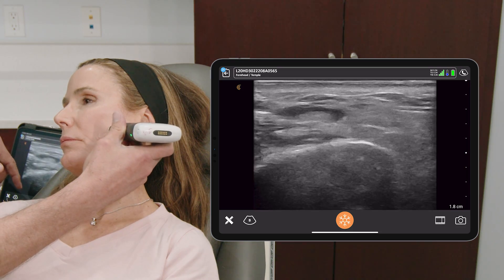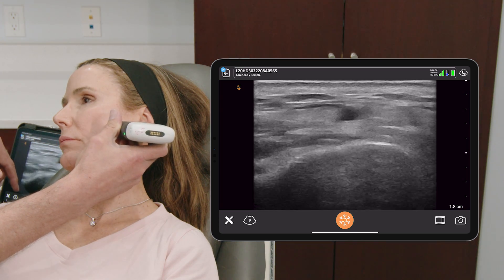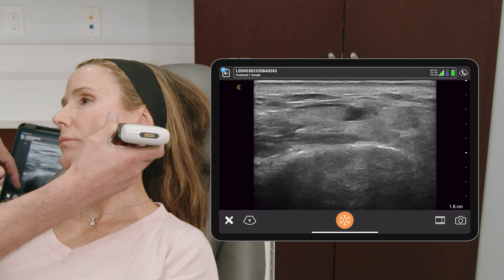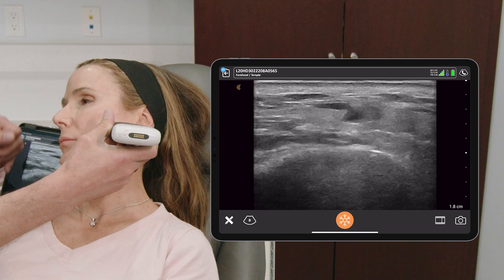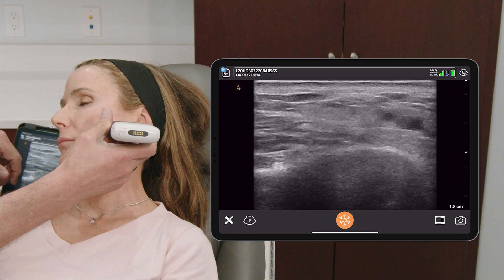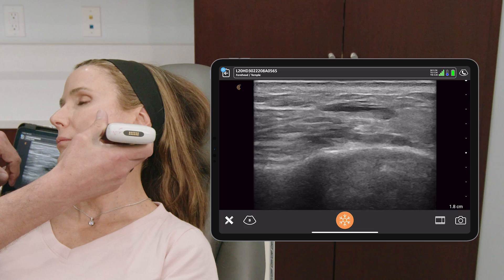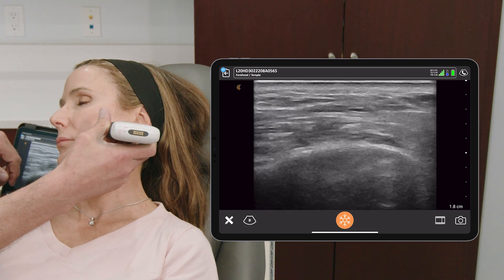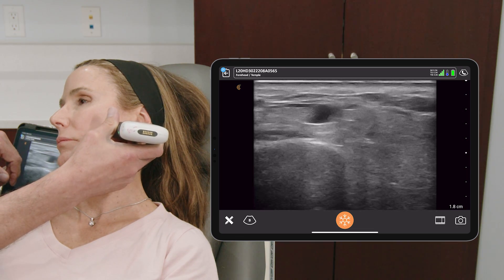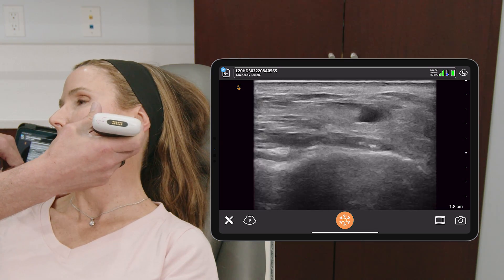Let's go a little more superior and you actually see within the parotid gland — in this patient there's actually a little bit of hyaluronic acid, which is fairly common when you're injecting in this area. I'm finding that on ultrasound and I'm actually delivering a talk about this at the MCATs coming up. She has a little bit of HA superficial to the parotid, but if you go a little bit deeper you can see some HA within the parotid gland. The parotid gland also has lymph nodes within it, and sometimes HA can be a little bit confusing with lymph nodes.